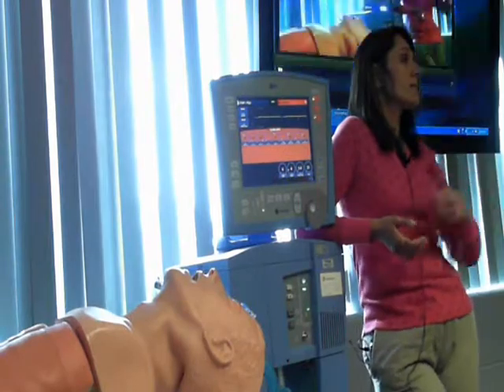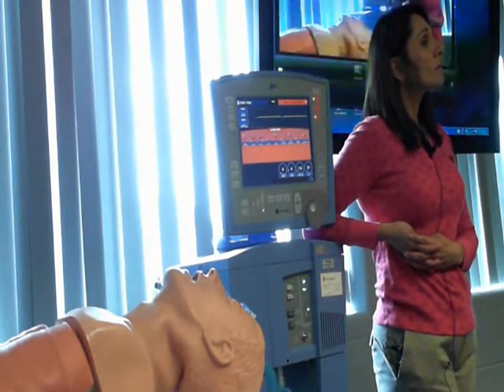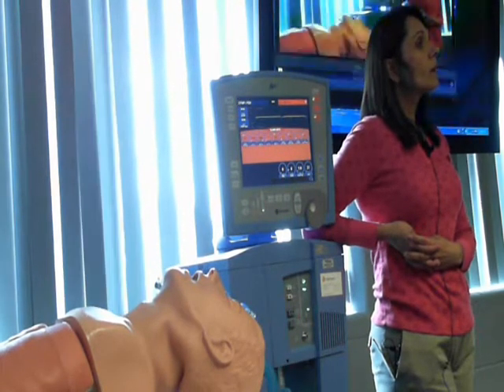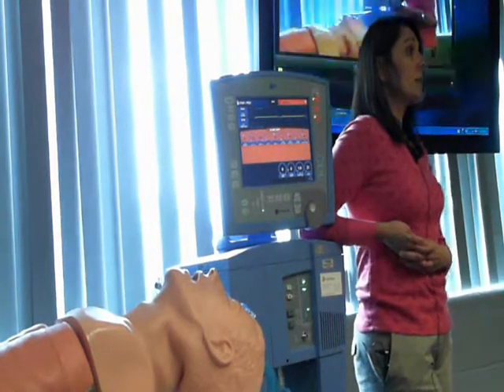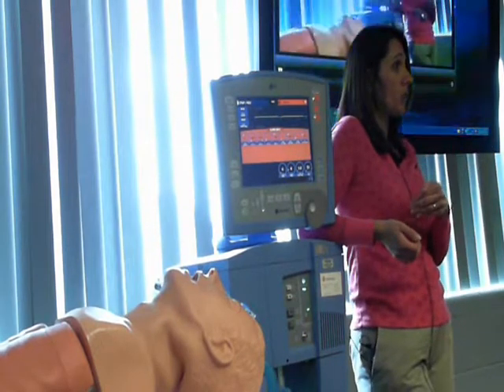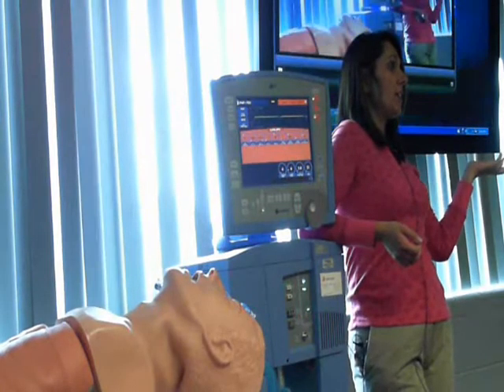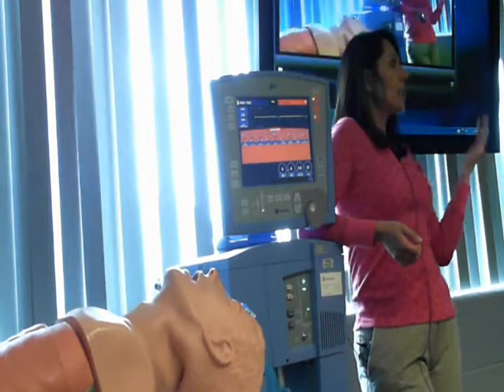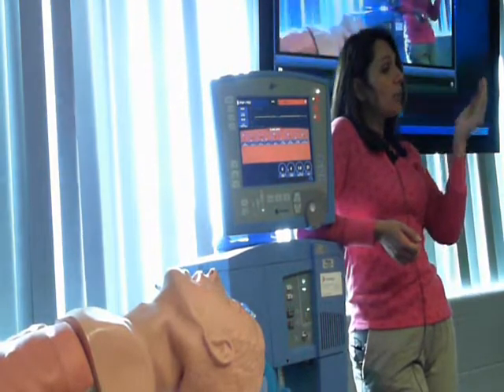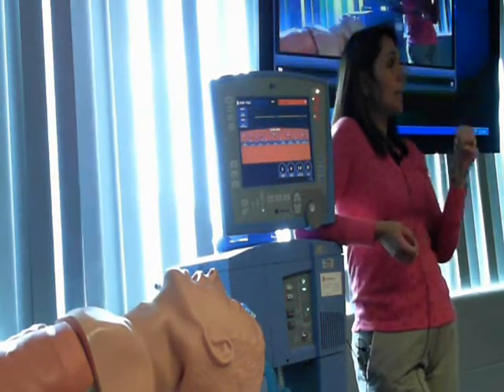Other questions? Yes. You're talking about weaning them off so that they don't become ventilator dependent. Is there a way that you can tell they're becoming dependent on it, without taking them off and they're just not breathing? Yes, there is a very specific process to weaning from mechanical ventilation. First thing you need to know is, why did my patient get mechanically ventilated? And then we look for, is that reason corrected? And then we begin a process of weaning them. It will depend on the reason they were intubated.